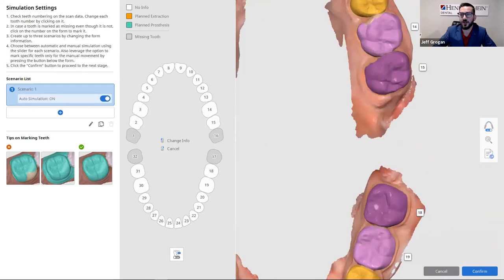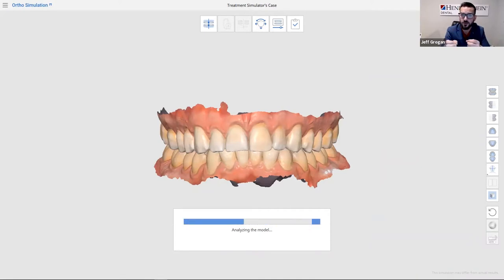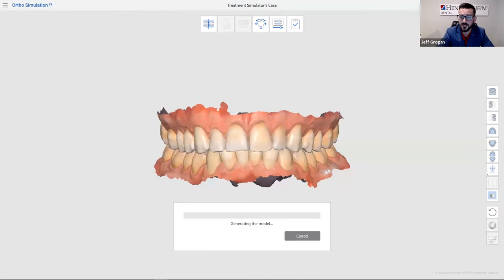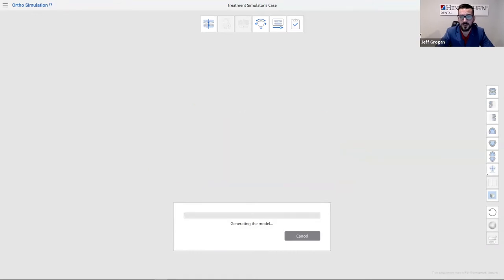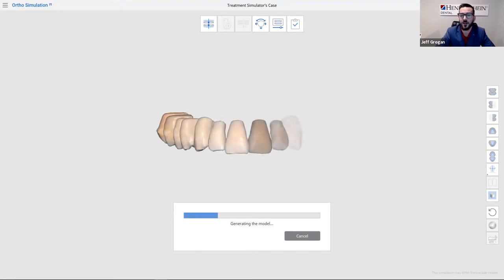Now that our model is segmented, it's going to virtually and digitally separate tooth from tissue, tooth from tooth, so we can start to play with the virtual setup of the teeth and look at different measurements, analytics, and everything else. As the computer generates my model, you can see where it has segmented each individual tooth, and then we'll move on through the ortho simulation process.